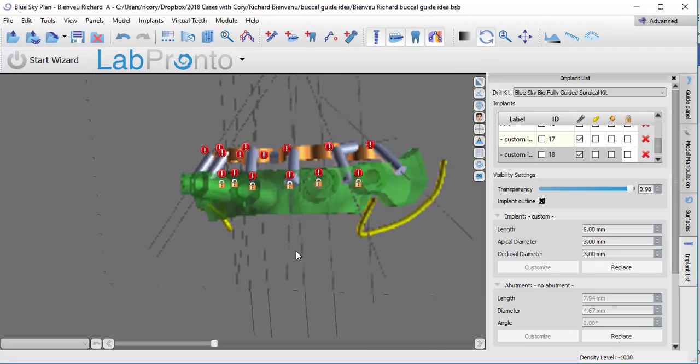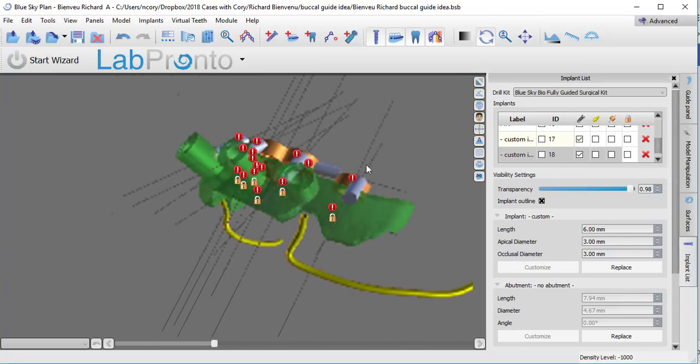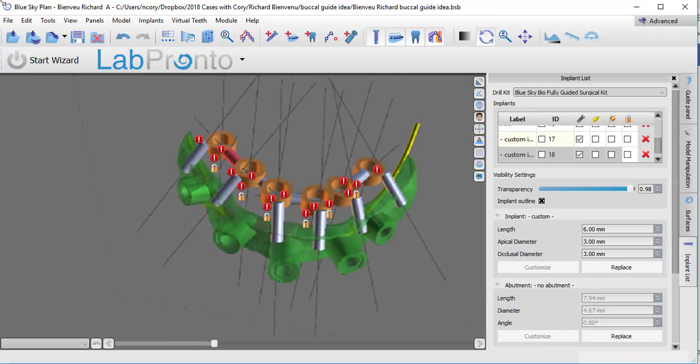So now this is going to become our drilling guide. What I need to do is export all of these surfaces that I have visible right now. You've already got your pin tubes, which are the same as the previous reduction guide because this is the reduction guide. And now we're just going to export all of these implants and all of those tubes.